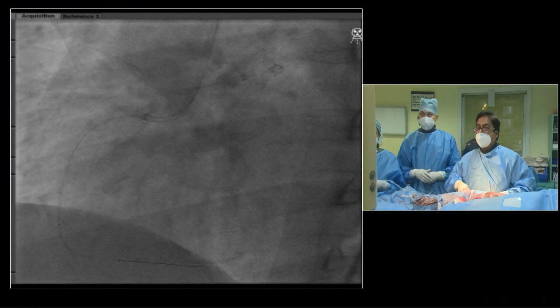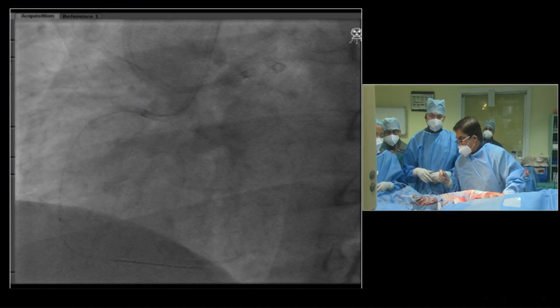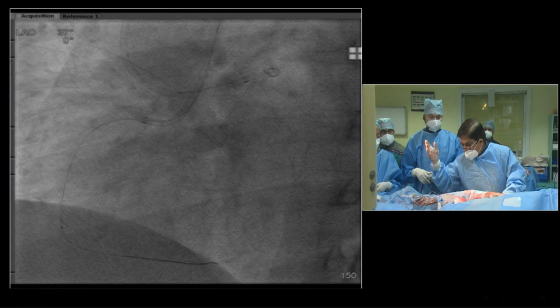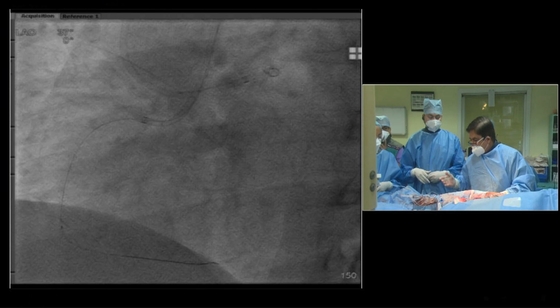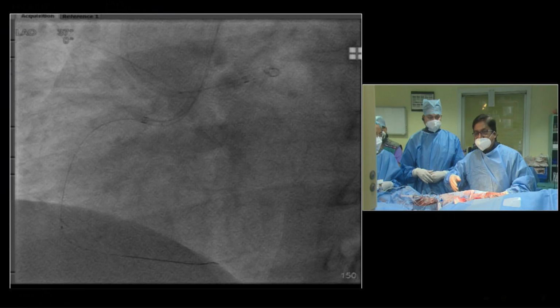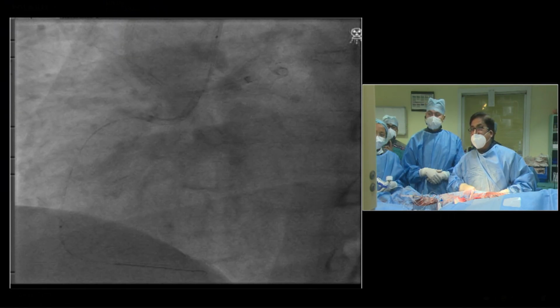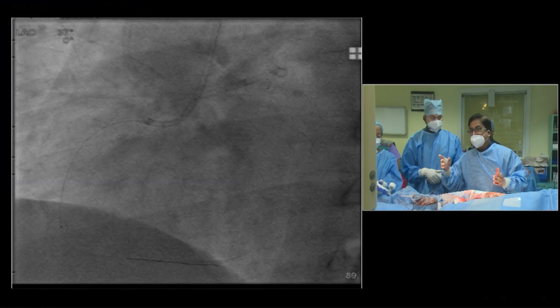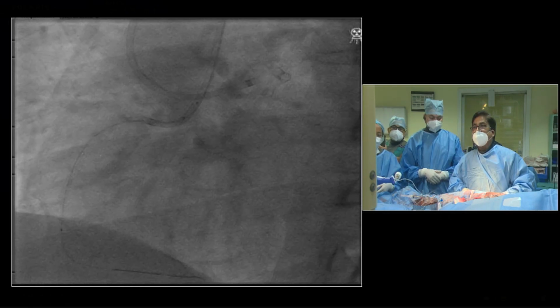I'll tell you what. With Gaia 3, I need control on the wire. Gaia 3 will move like butter, and you don't know where the damn thing will go. It's like a very fine knife, or a needle. It will just go, and you will feel you are in that direction. It will go boom. So we have to be very careful. These wire manipulations look simple, but they are very fine manipulations. Very, very fine, I can tell you.